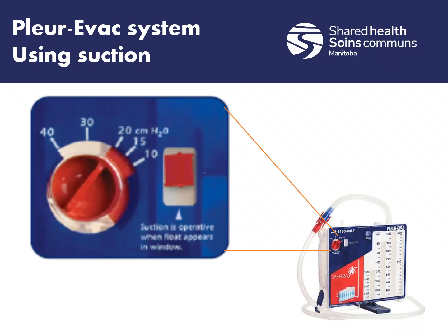To decide what negative pressure we want, there's a suction control, and that delivers from -10 to -40 centimeters of water suction with calibrated control. Usually it's preset, as you see in the picture here, at -20. It is up to the facility to decide what the negative pressure is. We are not going to touch that. We are not going to mess with that. If they want it at -30 with wall suction enough to just get -30 pressure, we're going to transport with that. If they want -10, we're going to transport with that. We are not to be changing that. This is prescribed by the sending physician.